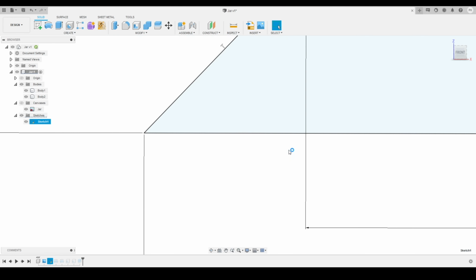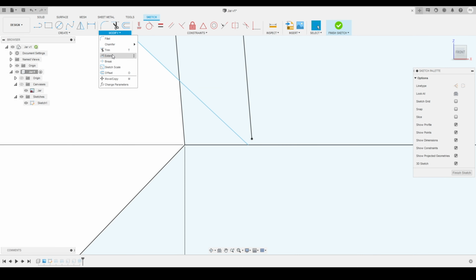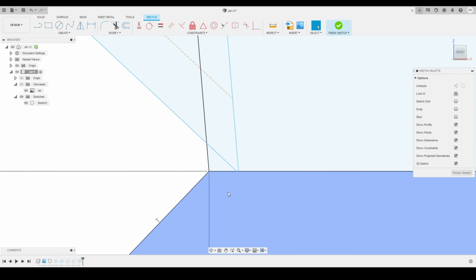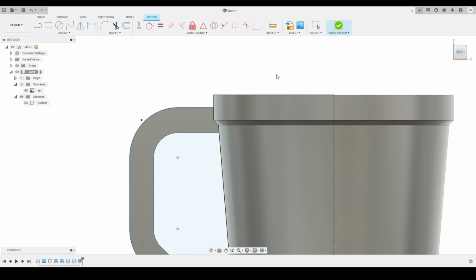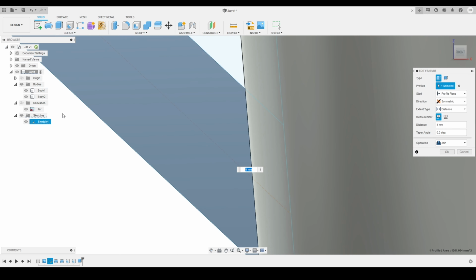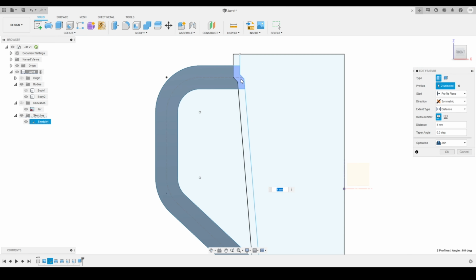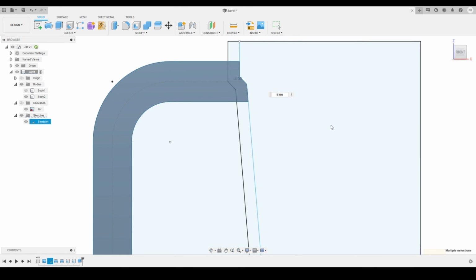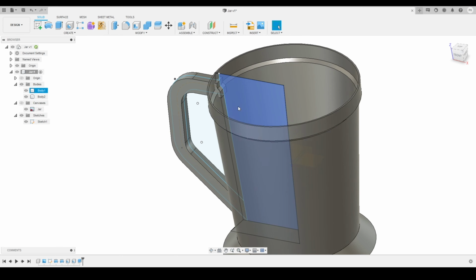And I will go to the sketch and double click to edit the sketch, and here you can see this is not touching at the bottom, so I will activate our extend tool and make sure that it is touching the bottom face. So now that will act as a closed profile, and I will click on finish sketch. If I double click on the extrude tool to edit that profile and add that left profile, here you can see, I adjust over here as well, and press OK, and this is the profile we got, and this is my main body.